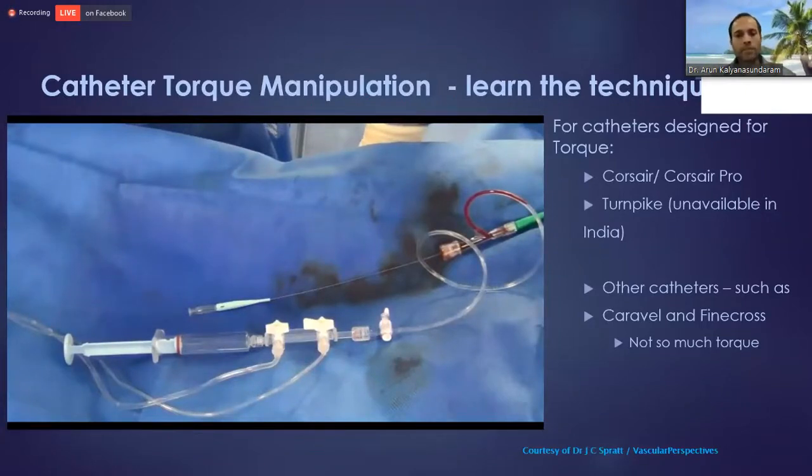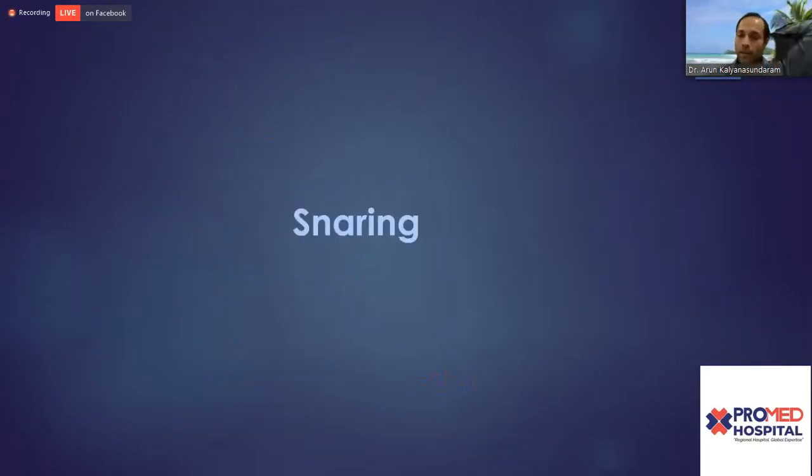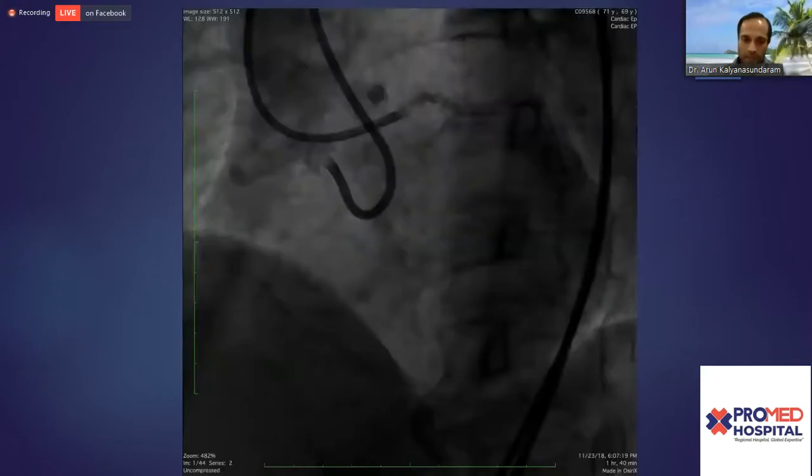Turnpike, once we get that, does better clockwise just based on how the braids themselves are. And if you cross the collateral and things don't really work, again, basics are enhanced support. If it's a septal, you can balloon the track. Always try a different microcatheter. If it's small, if all else fails, take a different collateral. And obviously you can enhance the pull if you've trapped the wire that you've already crossed. And snaring is another thing that many times has come to save me, and I think most of us should know how to do that.